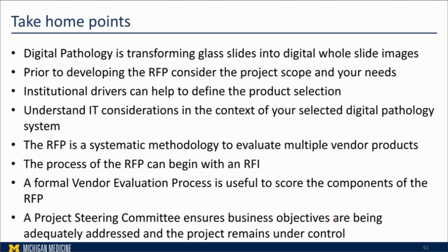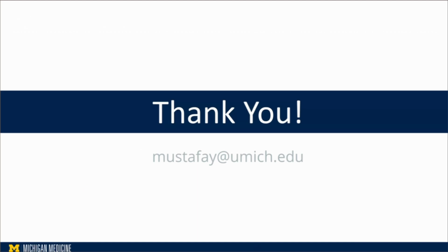Take-home points: digital pathology is, as I said, transforming glass slides into digital. Prior to developing an RFP, consider the scope and your needs. Institutional drive is extremely important. The RFP is a systematic methodology to evaluate multiple vendors. The RFP process can start with an RFI, and a project steering committee ensures business objectives are being adequately addressed, which is extremely important to keep the project under control. With that, thank you so much for listening, and I'm open for questions.